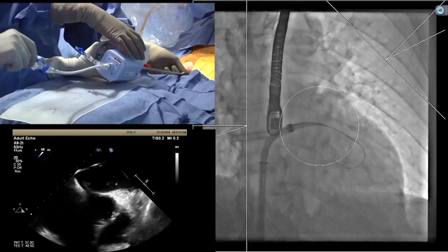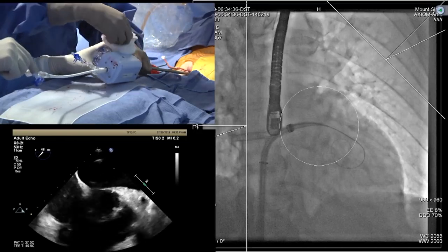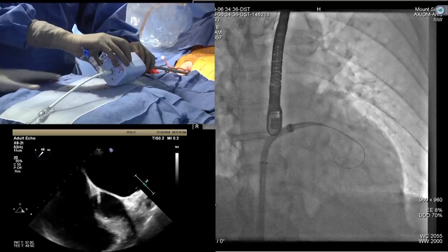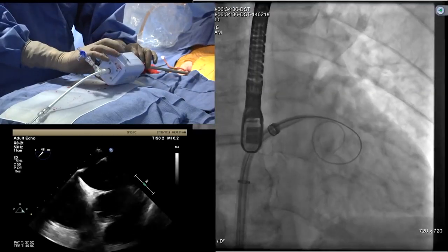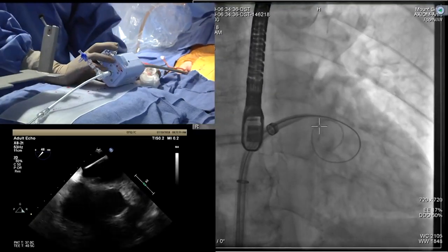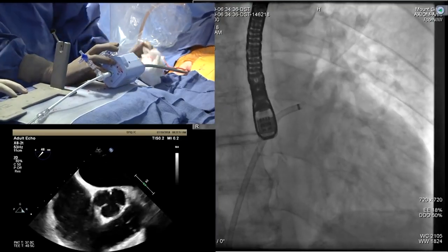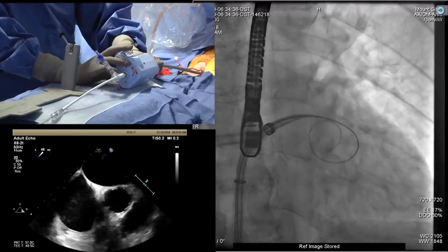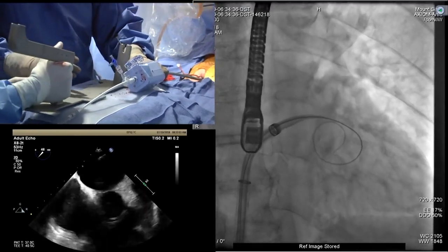That's an interesting point, which Philip mentioned as well: if it does not go, you take your handle here and do just gentle rotation, not aggressive. If it does not go, then you take the whole thing back, and with the technique that we showed in the past, you may have to balloon dilate there before you get in. Yes.